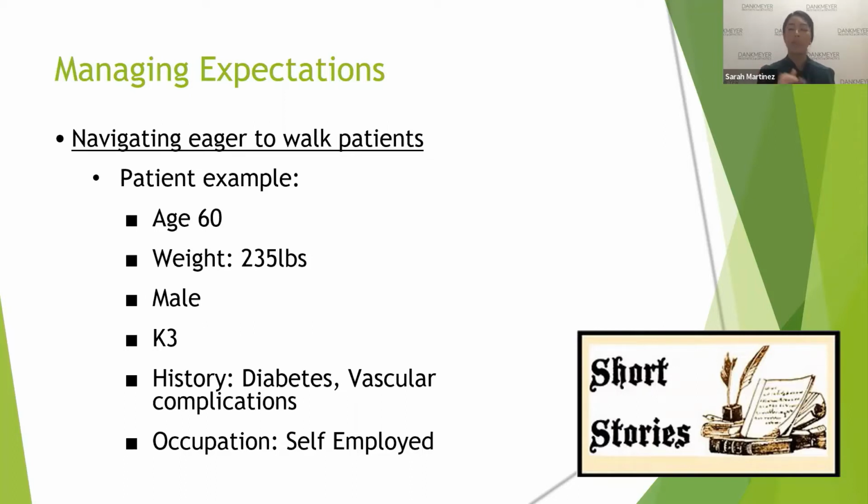So the next step is that I cast the patient over his liner, and on our end, we begin to fabricate what's called a test socket. And I have a test socket right here. And I'll go into a little bit more depth of why we do test sockets in a moment. So we schedule the patient back in, and the test socket's all ready. He dons his liner, and I go to put on the test socket, and it doesn't fit.